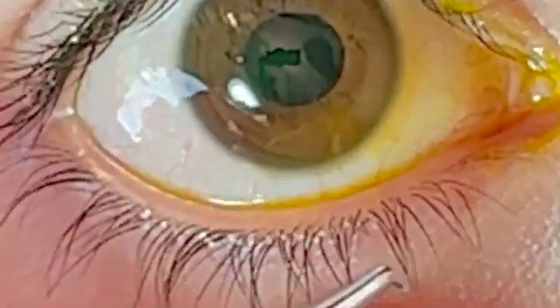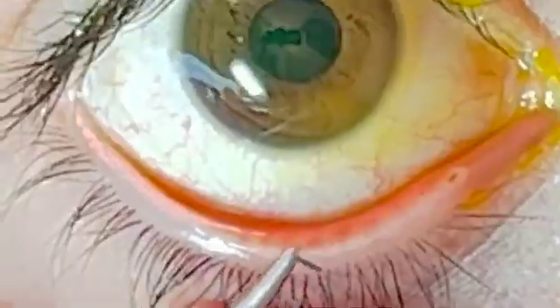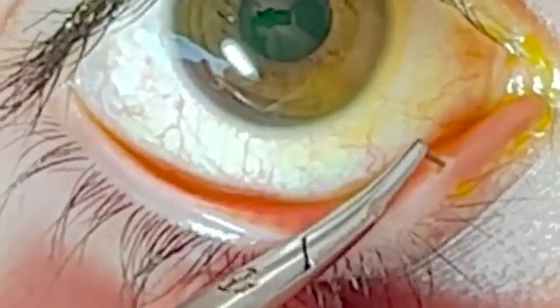Then, with the needle holder, you hold the super tiny collagen plug. You really have to understand just how tiny this device is. And then you insert the collagen plug into the dilated punctum hole. After setting the plug into position, you use the needle holder once again, this time to push the plug deeper to steady it. Now once again, use the punctal dilator, but this time to push the plug into the final place internally within the eyelid.